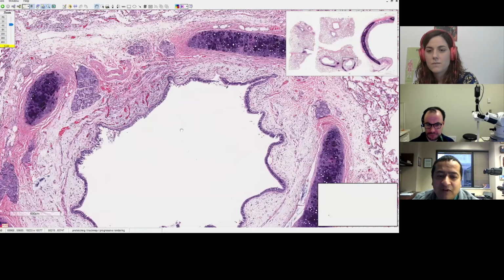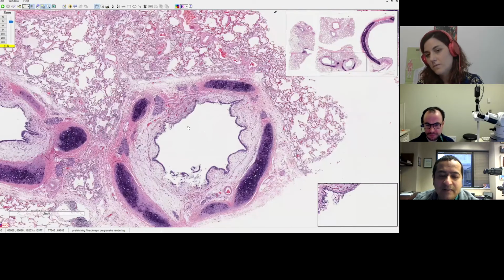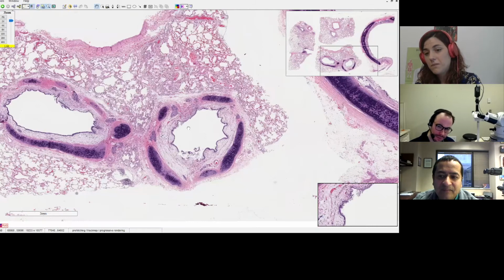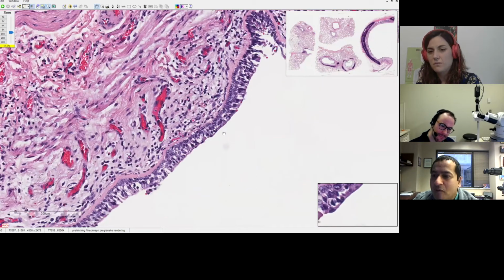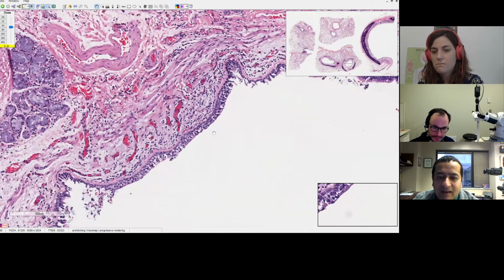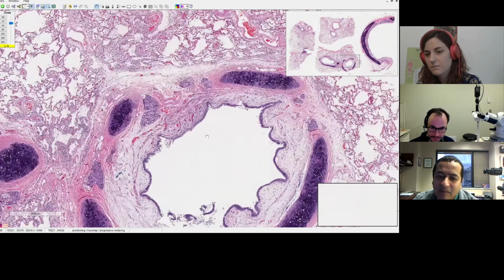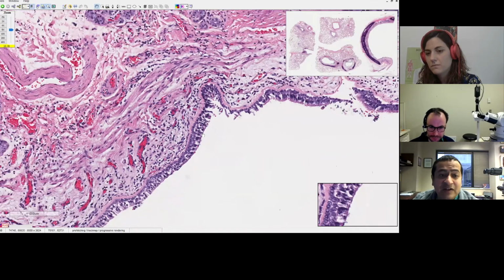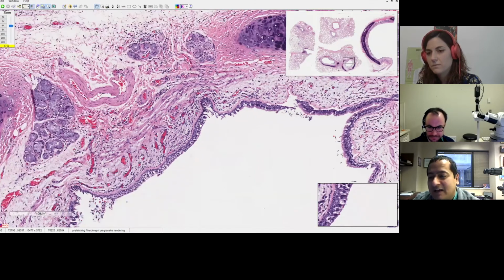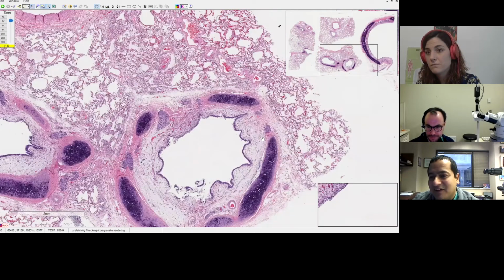But it also has inflammation. Do you guys agree? A little bit of bronchial mucosal inflammation. But maybe bronchi normally have this inflammation. There's a little bit of basement membrane prominence there, right? Oh, yes, a little bit of basement membrane thickening. But that's really not that specific. None of it is specific. In fact, you can argue that even DAD is not specific at all. So nothing here is specific, right?